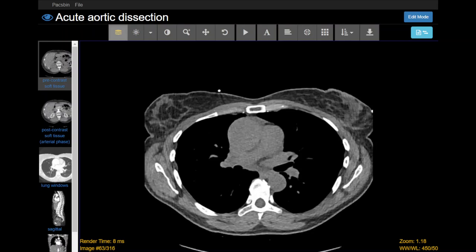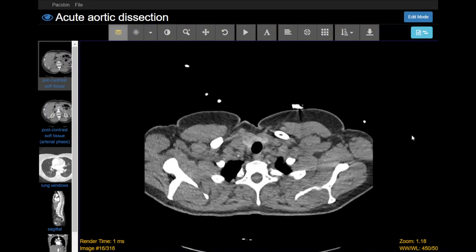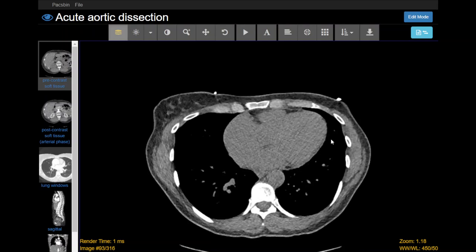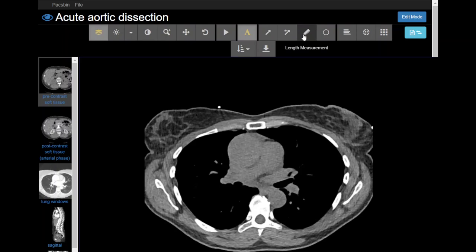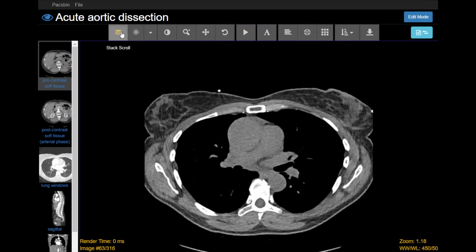We're going to take a look at a case of acute aortic dissection on CT. Here's a CTA of the chest with the thoracic aorta protocol. This includes a pre-contrast series. You can see that the chambers of the heart and the great vessels are dark. This helps us evaluate for findings like an intramural hematoma or intimal calcific displacement. Neither of those findings are present here, but what we already notice is that the ascending aorta is dilated. You can go ahead and measure the diameter — it's about 4.6 centimeters, so we already know there's either a dissection or an aneurysm.